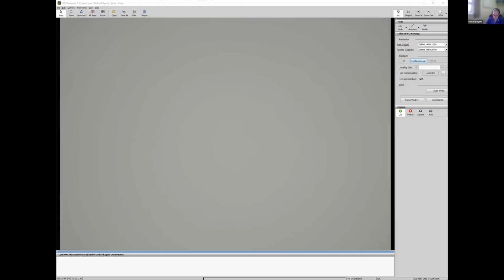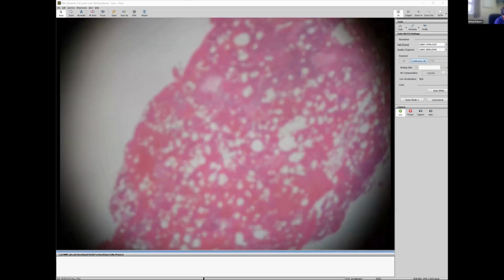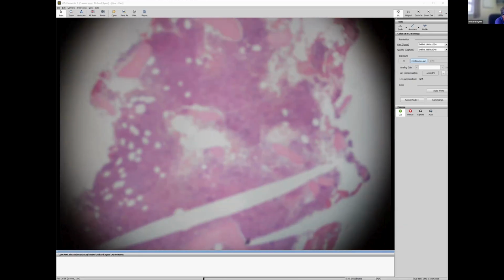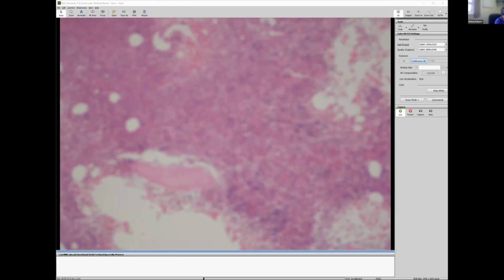So I just want to have a look at this one carefully. It came from another hospital. Sometimes the history we get when they come from another hospital is a bit variable. So this is it.